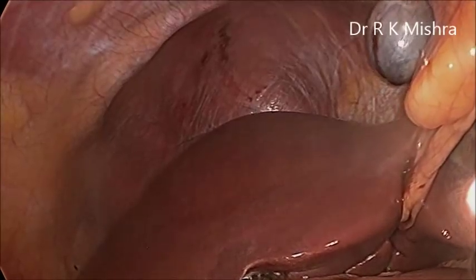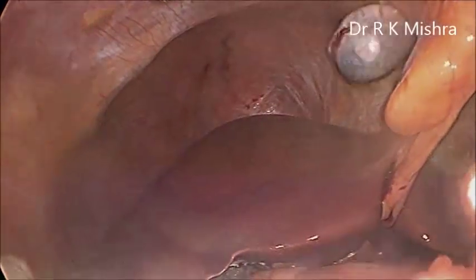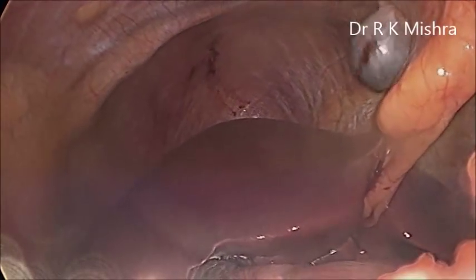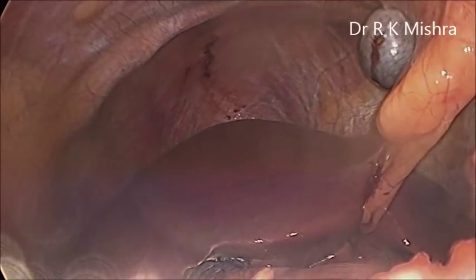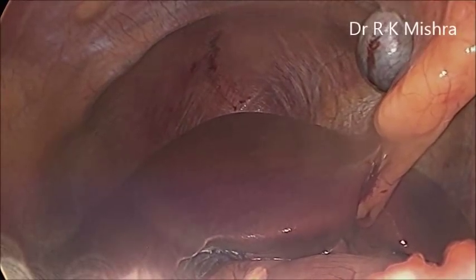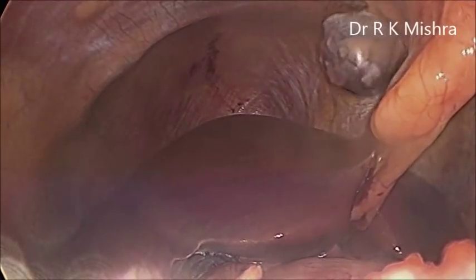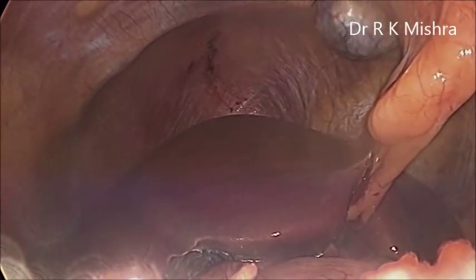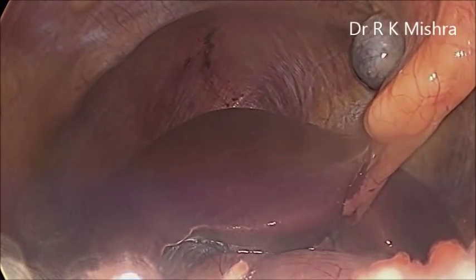Care should be taken that excessive force is not applied, otherwise at this point also sometimes the gallbladder ruptures, and then it will make your surgery messy. So patience is the key in laparoscopic surgery. If you want to become faster, you will be slower. So here it is, slowly the stones have to be taken. There were multiple stones, that's why.